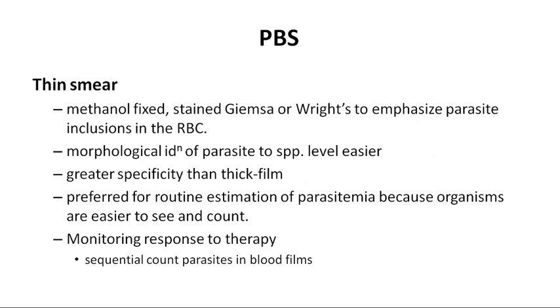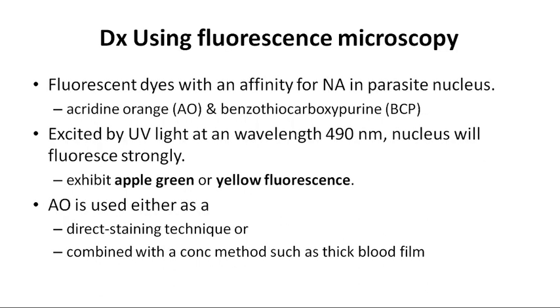It is assumed to have greater specificity than the thick film because the morphology of the parasite is easily visualized. It is preferred for routine estimation of parasitemia because organisms are easier to see and count. It is also helpful in monitoring the response to therapy because a sequential count of the parasite in the blood film can be done.